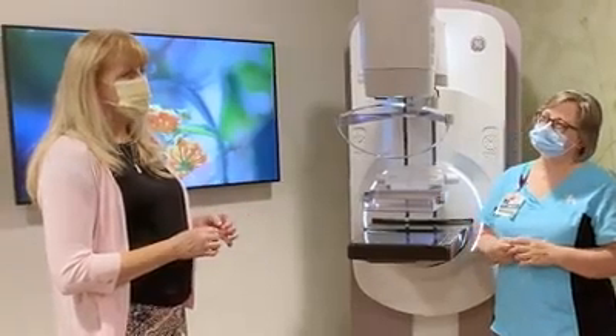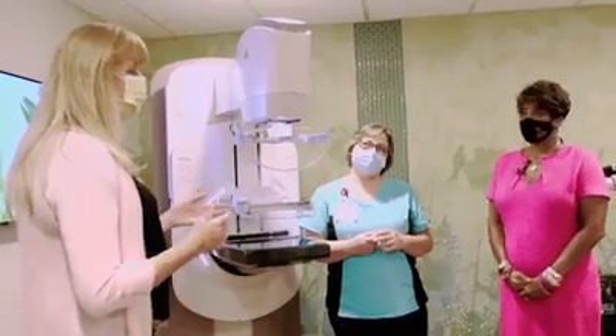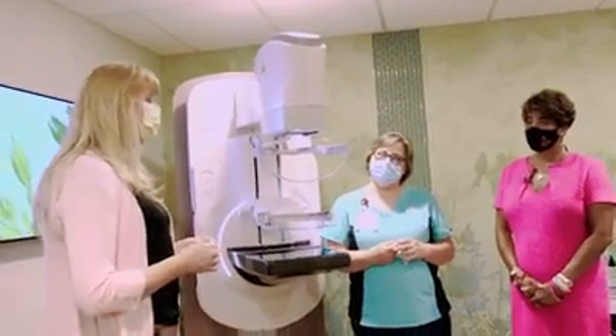We've actually seen women compress themselves more than they would ever let us compress them. It's really that old saying where if I pinch you it hurts, but if you pinch yourself it doesn't hurt quite as much.